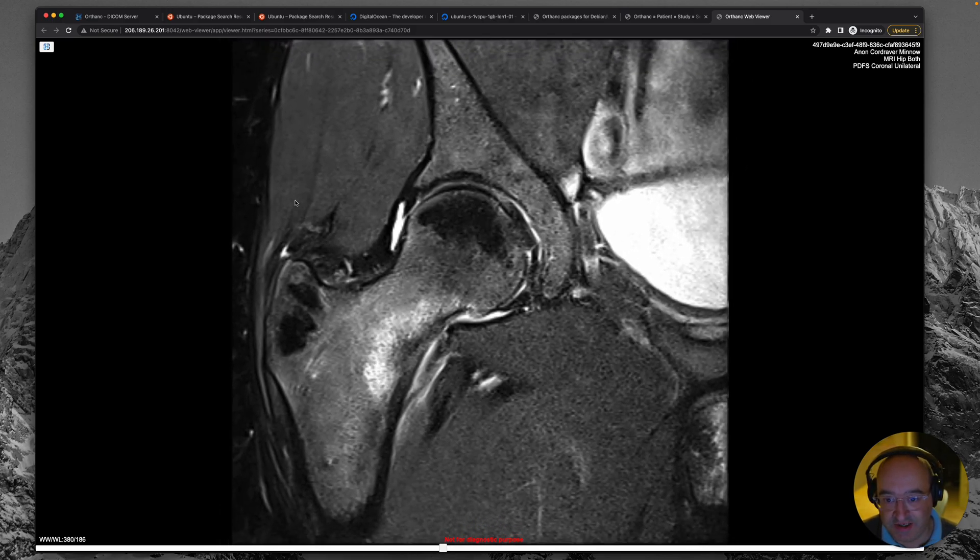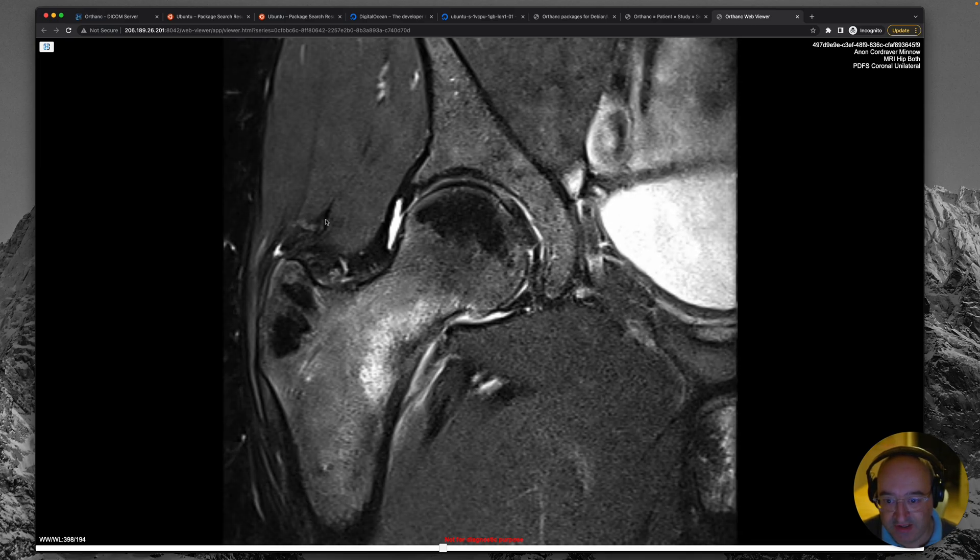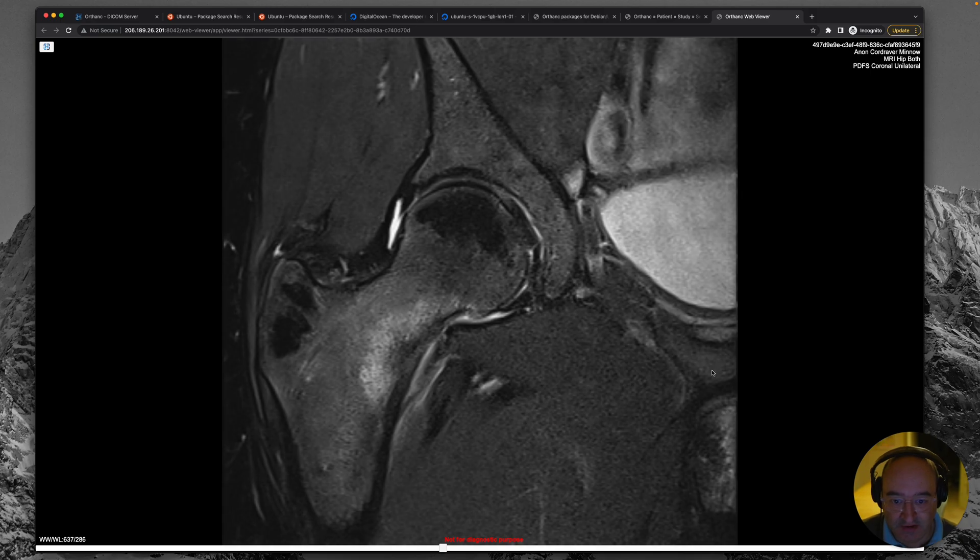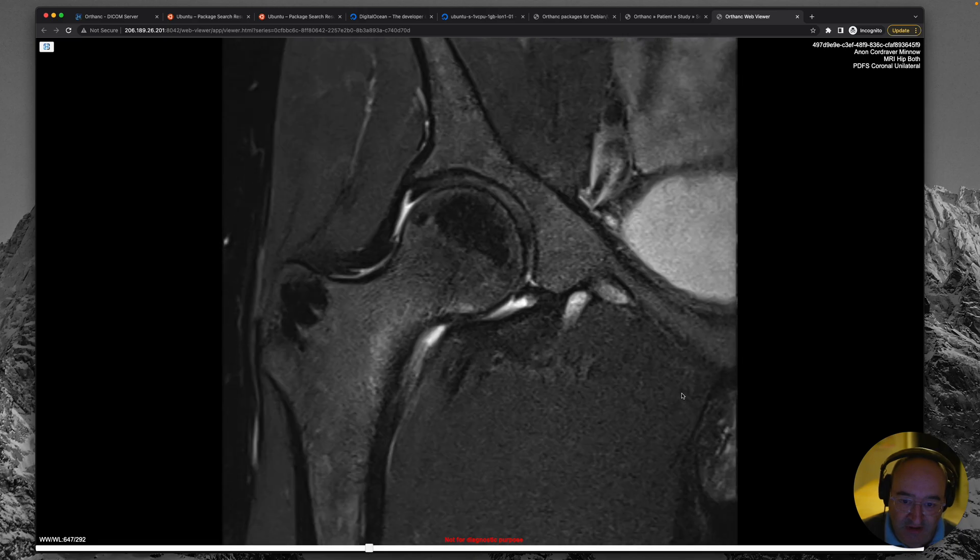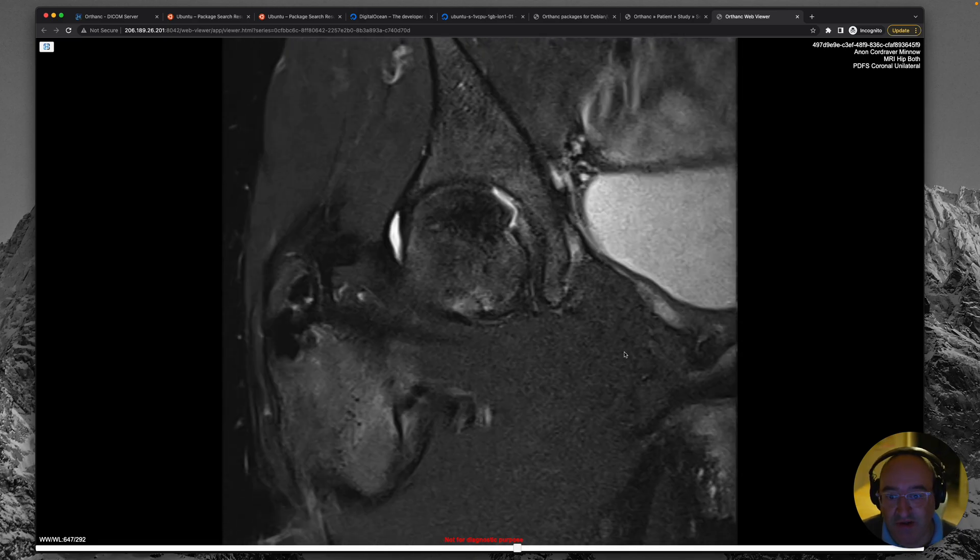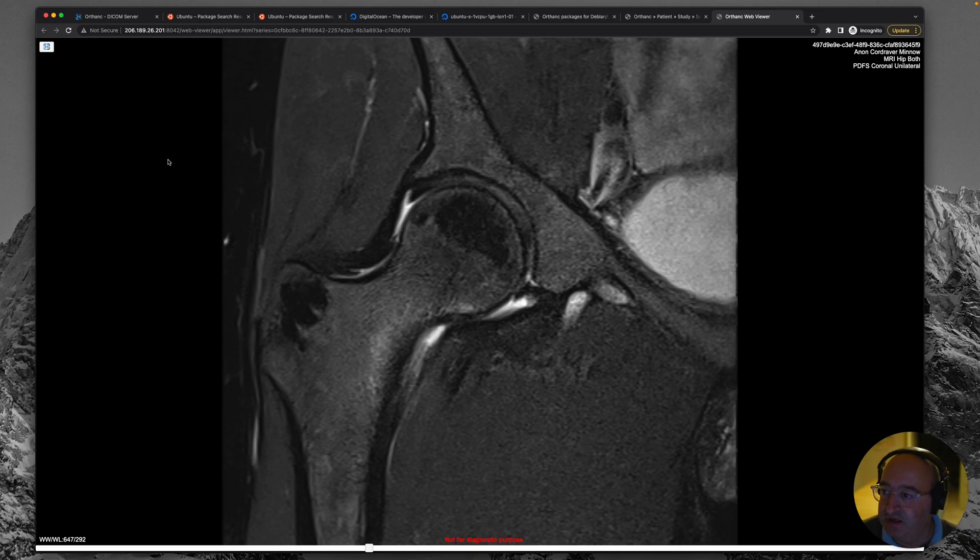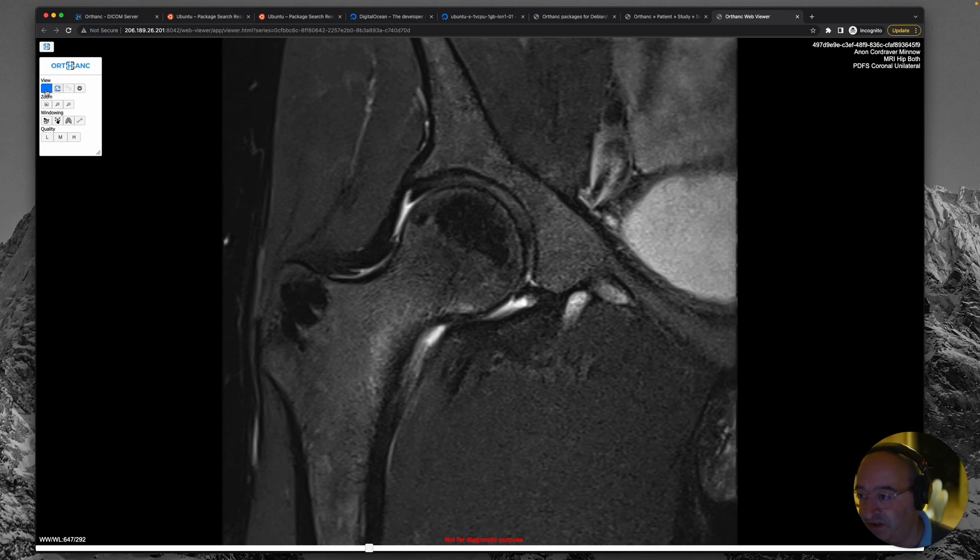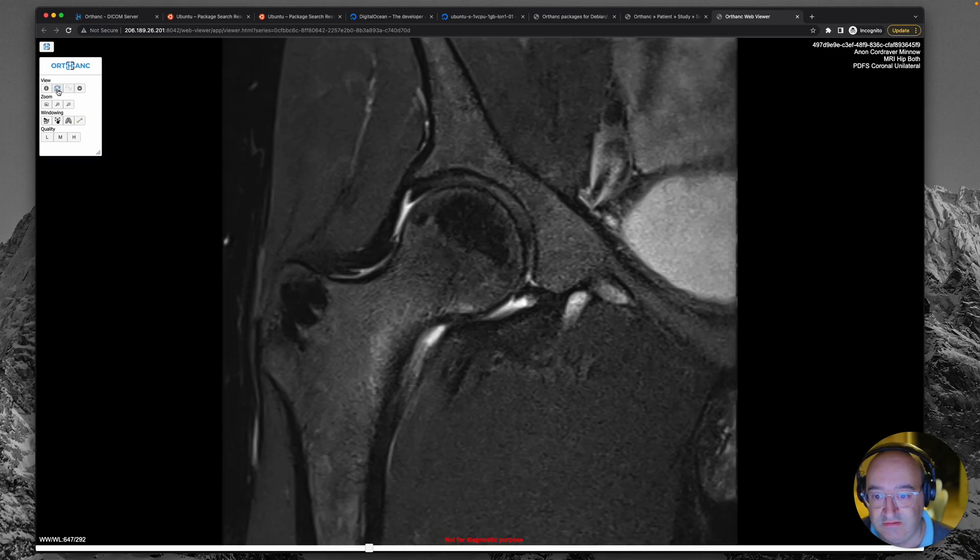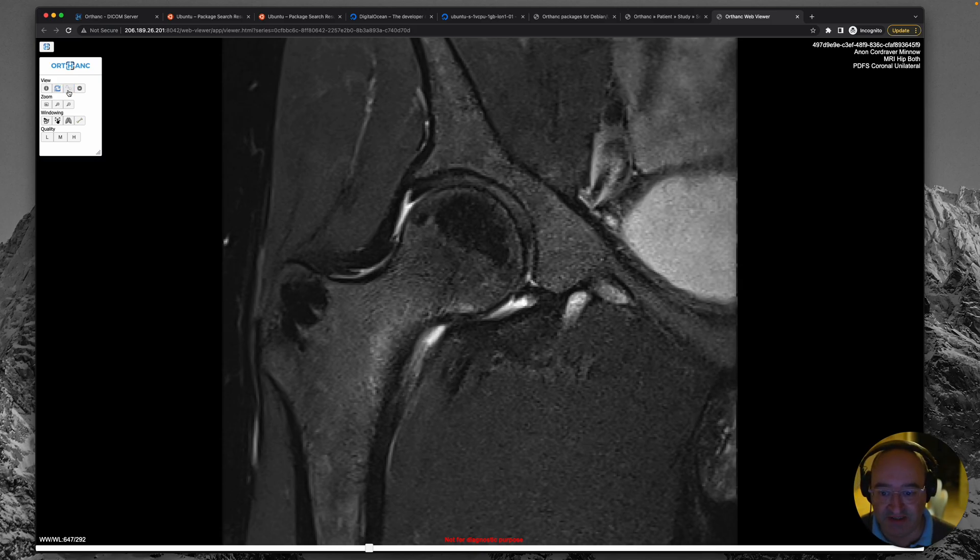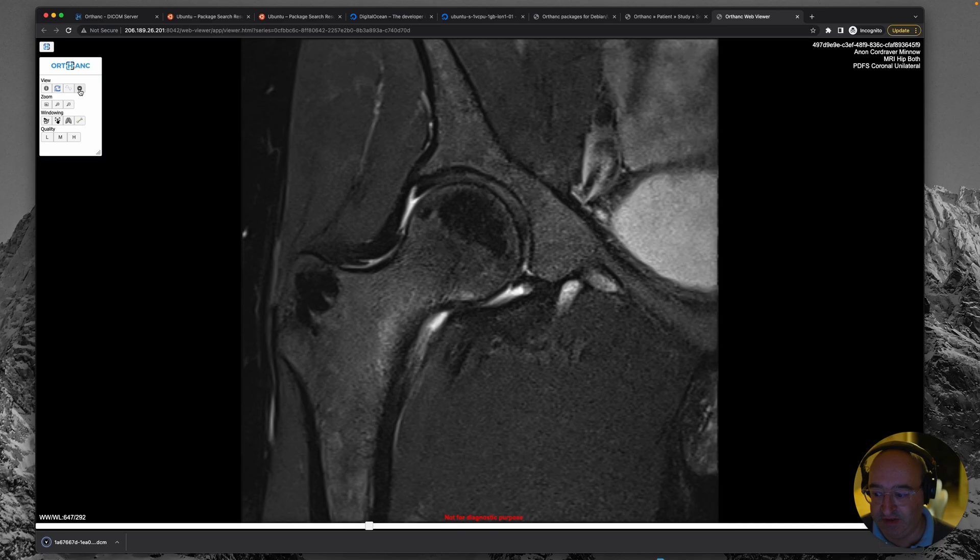So let's see what you can actually do with the viewer. So I'm right clicking and that's letting me zoom. Left clicking and dragging and I'm getting windowing. Yeah, that's good. Nice and sensitive as well. I'm using the mouse wheel here and that's scrolling. A little icon over here. What does that have? So there's a bunch of options and that turns on and off the overlays. That's invert. Oh, that did some weird like pixelization thing. Maybe it's sharpening or something.